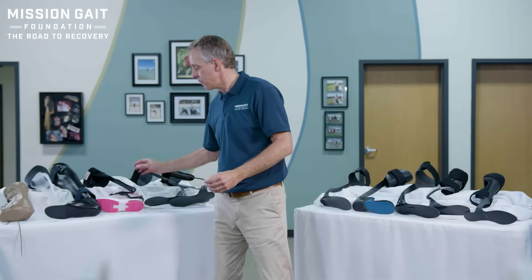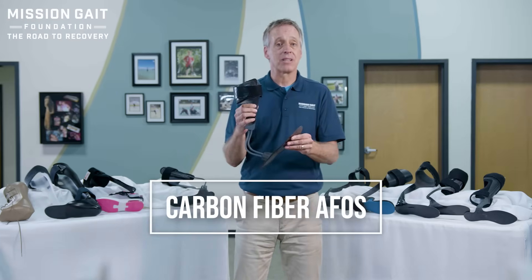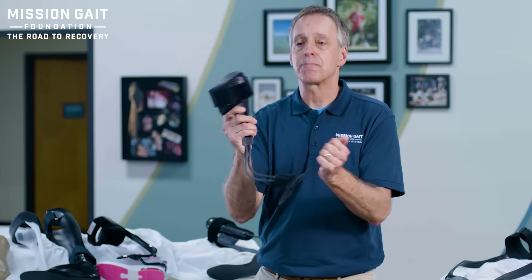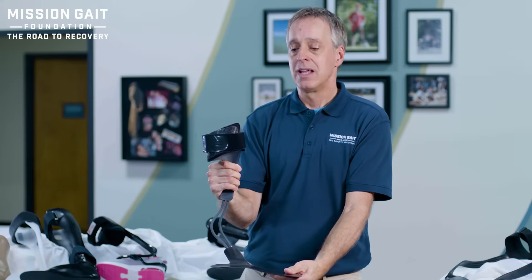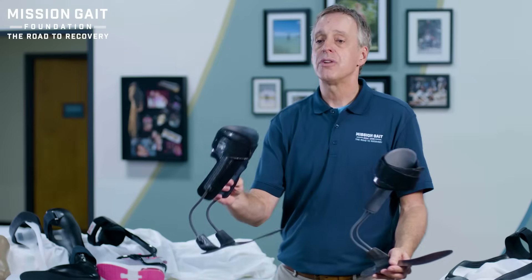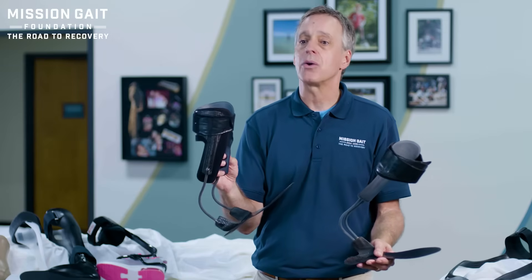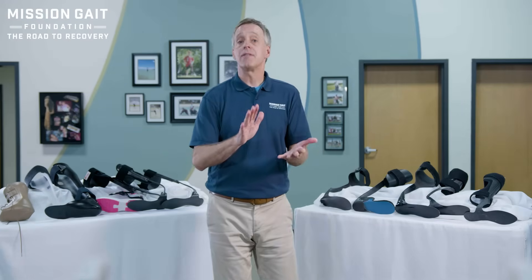Next are carbon fiber devices. Carbon fiber is very popular today because it's extremely light — much lighter than plastics or steel — and has great resilience. As you bend it, it springs back with a lot of energy, which can give you propulsion and assistance. In this particular brace type, it simply holds you up. You're in a neutral foot position and it lifts that foot up when you go to take a step so you don't trip. That can be set up from one-sided to two-sided for more lift, but the same premise: simply lift my foot up so I don't trip.